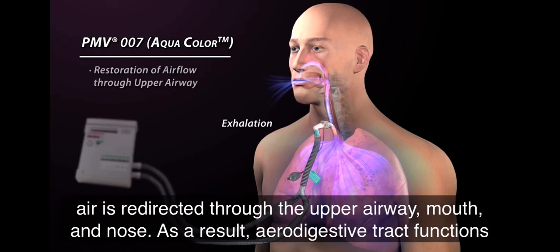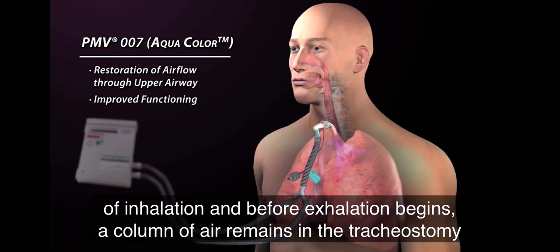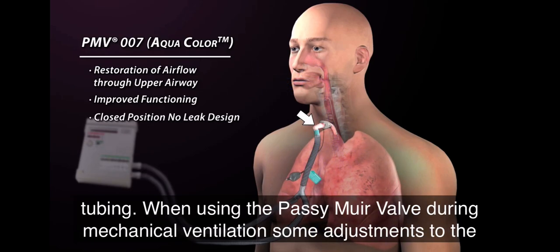All exhaled air is redirected through the upper airway, mouth and nose. As a result, aerodigestive tract functions such as speech, cough, and swallow are improved. Because the Passy Muir valve closes at the end of inhalation and before exhalation begins, a column of air remains in the tracheostomy tube and provides a buffer, preventing secretions from entering the Passy Muir valve and ventilator tubing.